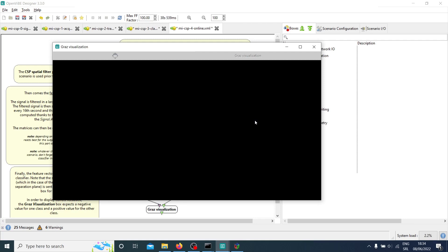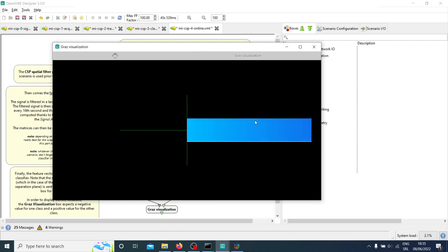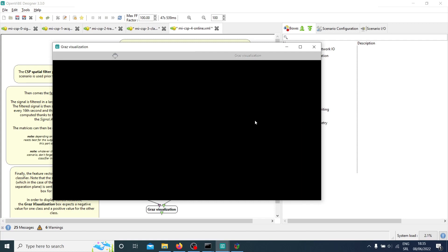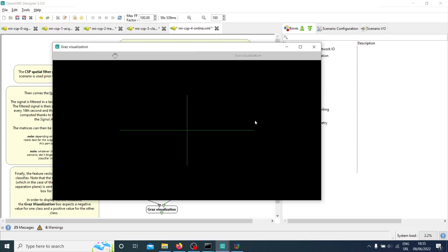You can see the online feedback: when the participant imagines right hand motor imagery, the feedback bar moves to the right; for left hand motor imagery it moves to the left. In our case it's a bit random since we're using fake oscillating signals, not real EEG — but that's basically the whole pipeline. That's all there is to it.